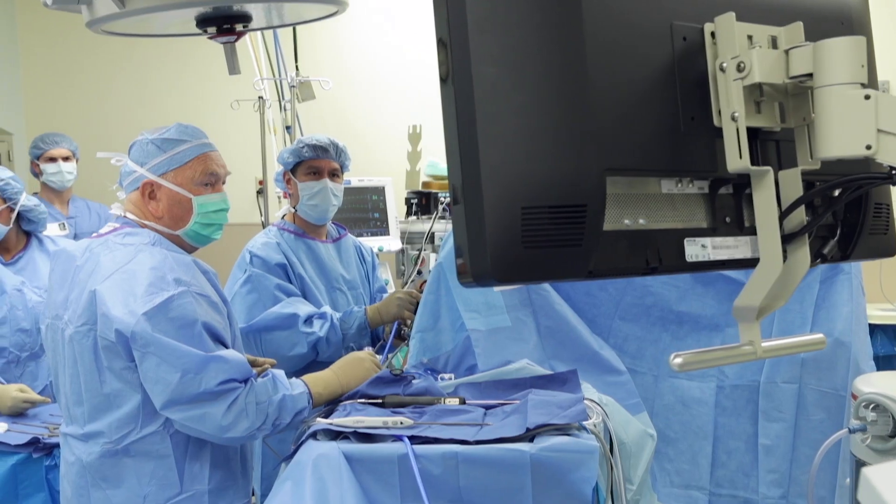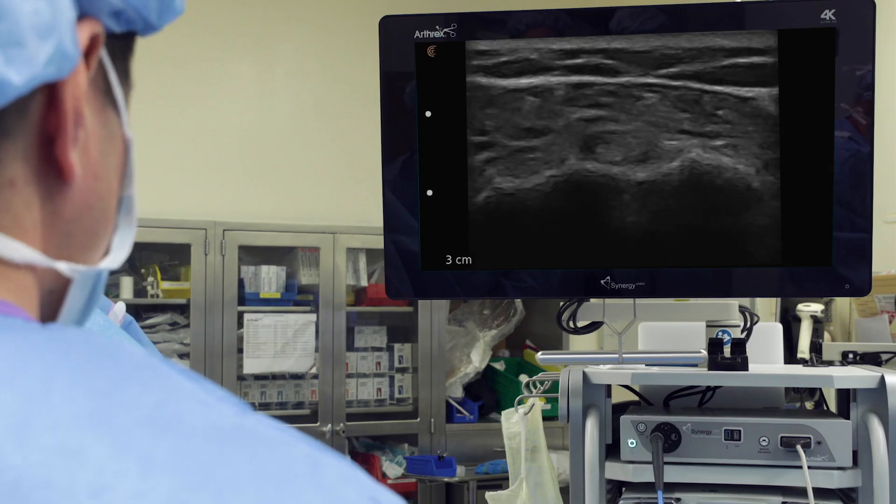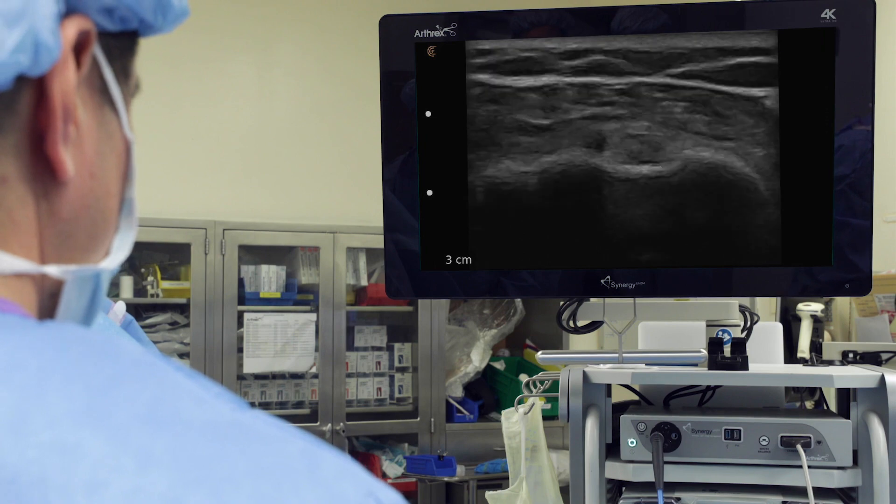The app-based system allows for easy field upgradeability for future features, such as seamlessly transmitting images in the OR to the Synergy UHD 4K imaging platform.